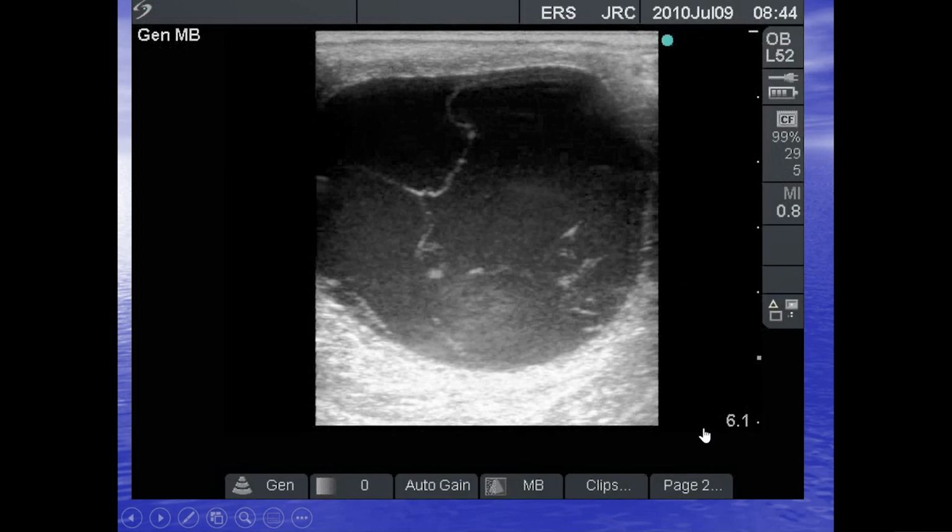Of course, these days we've got some pretty good laboratory tests to diagnose a granulosa cell tumor, so we shouldn't really make this confusion. But particularly if you don't examine large numbers of mares, you may think, oh, there's got to be something wrong with this mare's ovary. Absolutely not. It's just formed a hemorrhagic follicle.